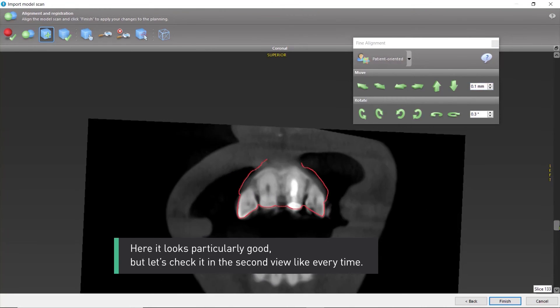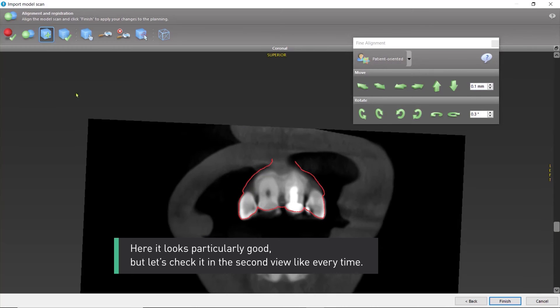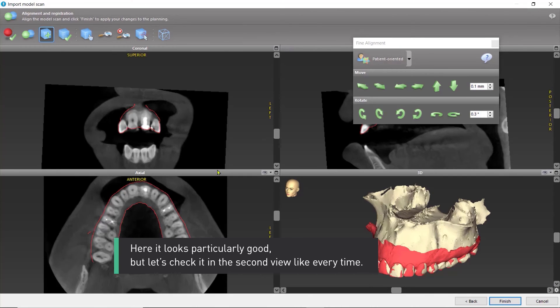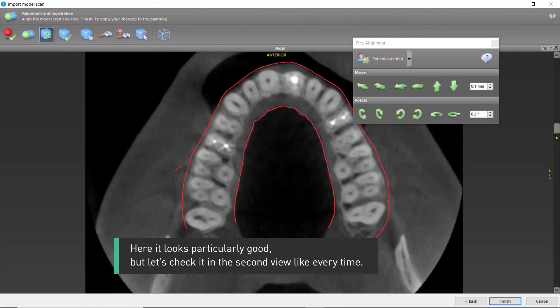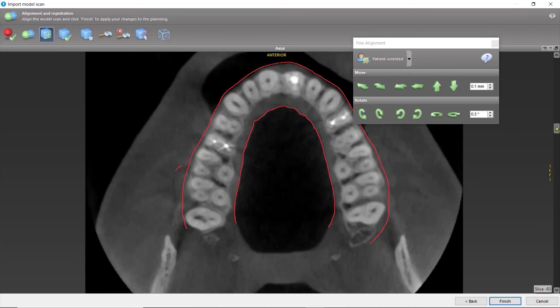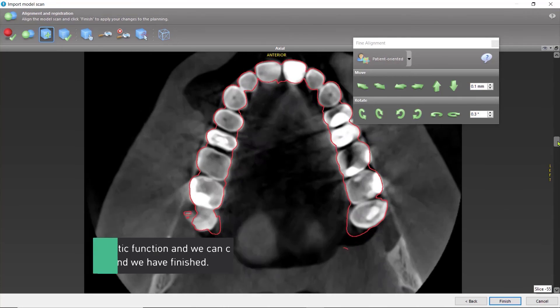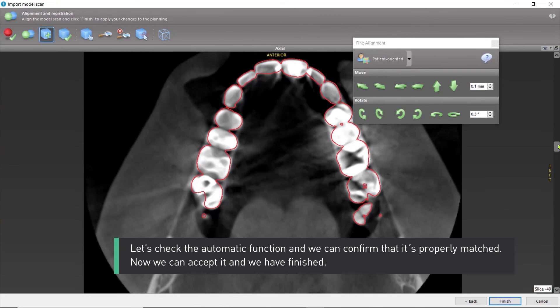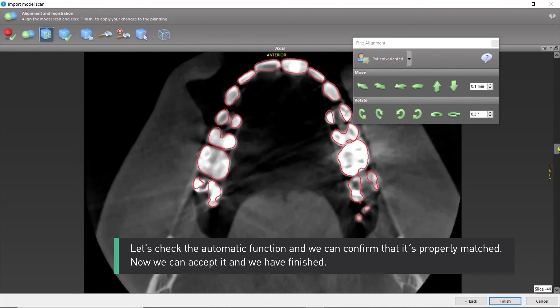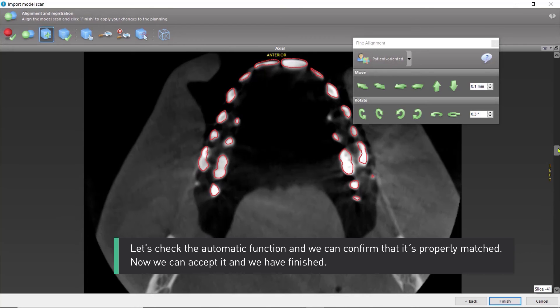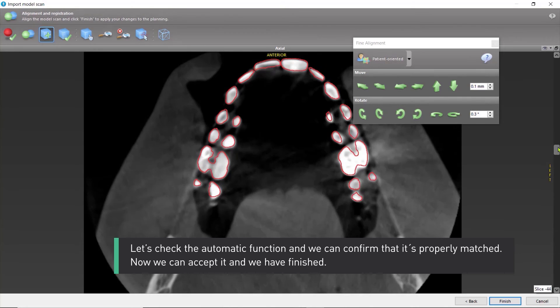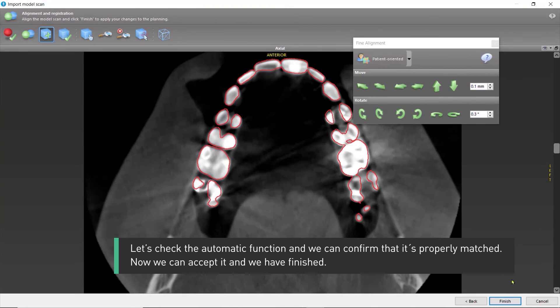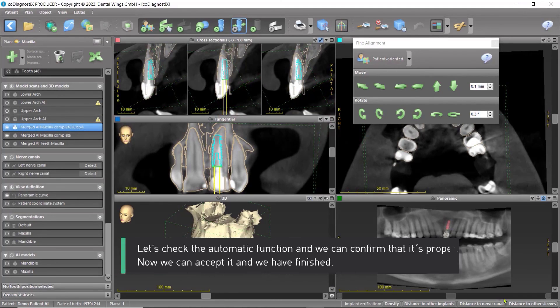Here, it looks particularly good, but let's check it in the second view like every time. Let's check the automatic function, and we can confirm that it's properly matched. Now, we can accept it, and we have finished.